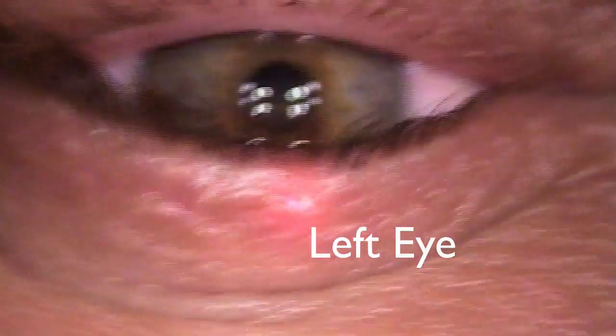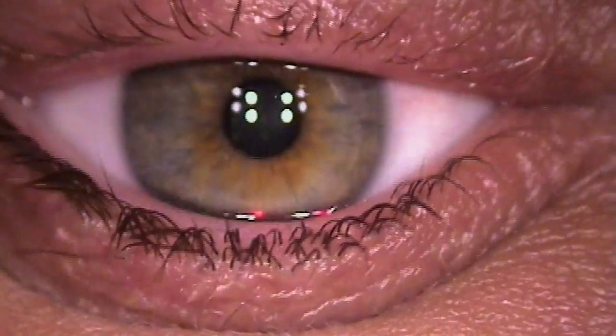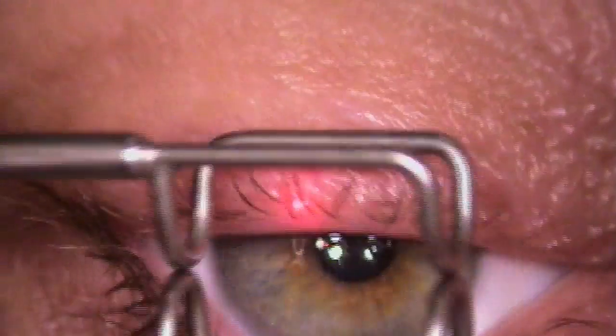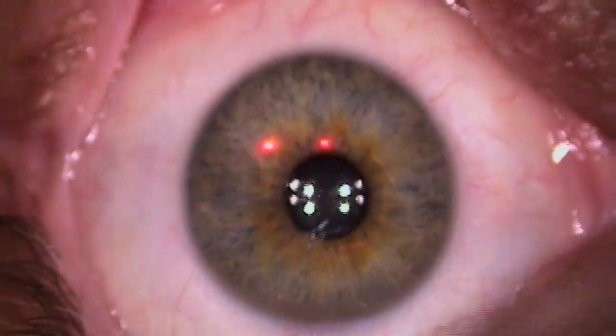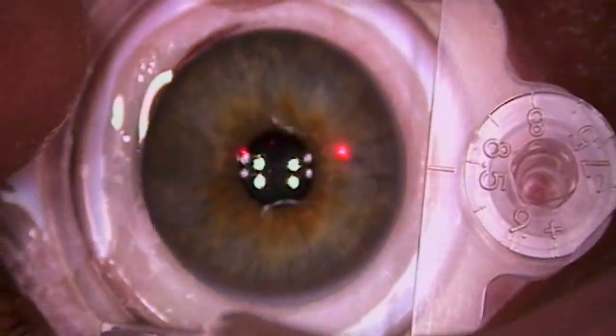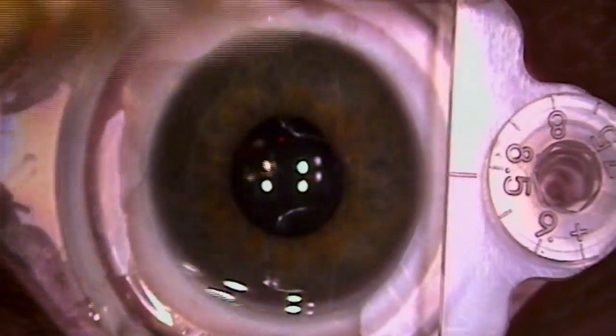All right. I'm going to put some more numbing drops in this one. Whatever you did the first time, do it again — you were great. There you go. I'm going to go ahead and push on you a little bit, try not to squeeze too much. Just like that.